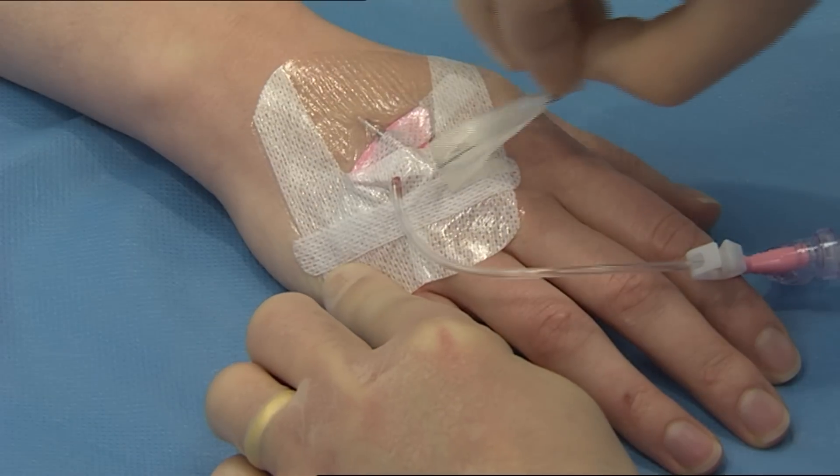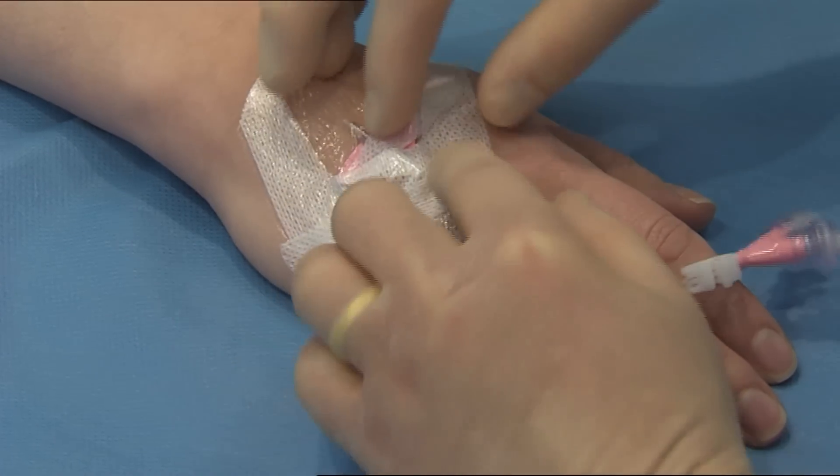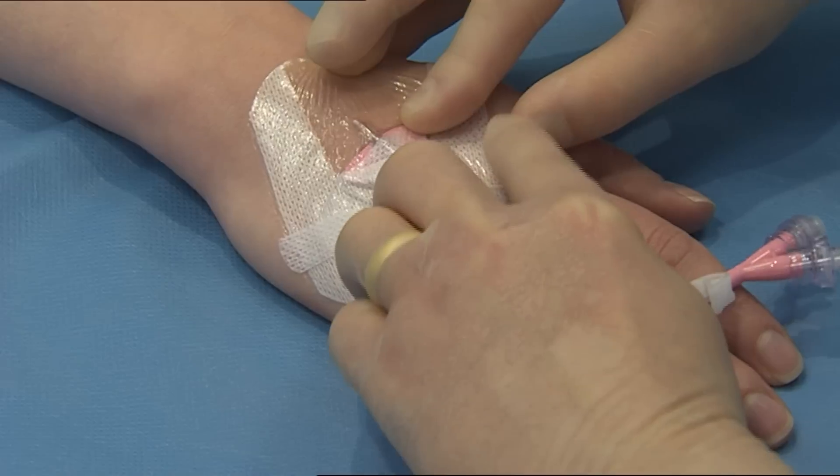Remove the date record label from the dressing. Carefully remove the first of the securing strips.